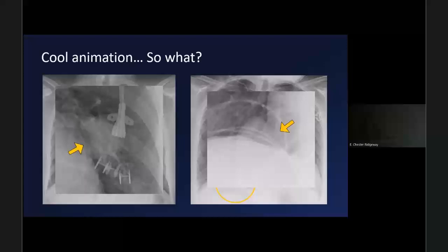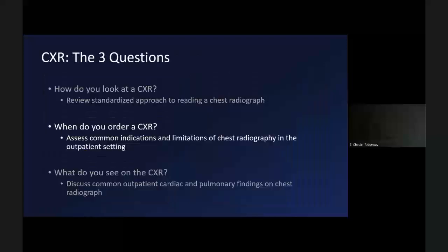So it's arising from the pericardium. It is not a parenchymal process. You do not see that thin dark line. So keep this in the back of your mind if you can, but we'll refresh on it when it becomes pertinent later on. All right, so that's our first question answered now.